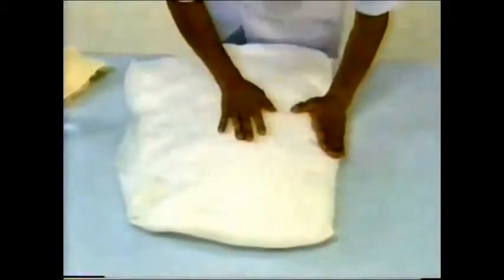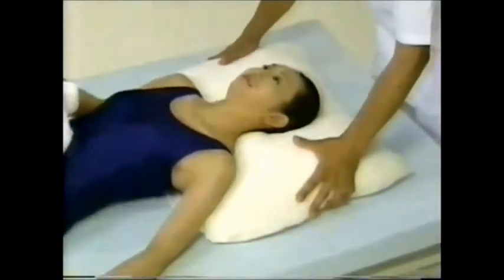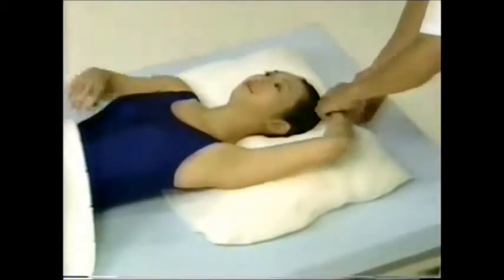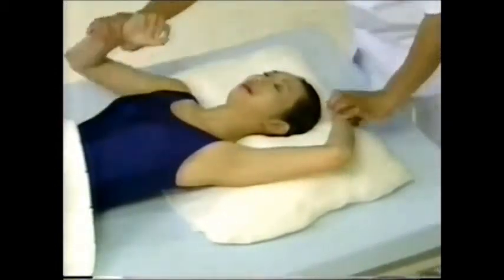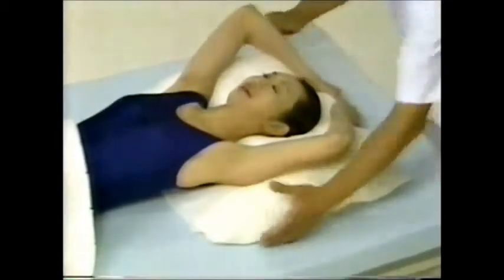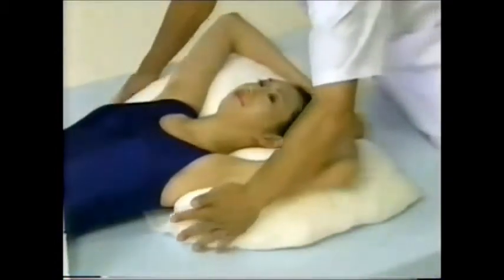After using a towel to remove excess water on the cover material, the device can be molded to approximate the patient's reclining position. This will facilitate molding when the patient is in place. The patient lies down on MoldCare RI-2 and molding is performed according to the body shape. In cases where the patient is required to raise the arms, the accuracy of immobilizing improves if the patient grasps the MoldCare RI-2 above the head. During molding, patient comfort is assured because the base material does not release heat and the patient's body will not experience significant wetness.